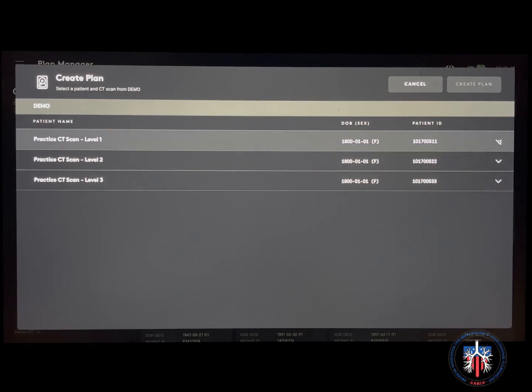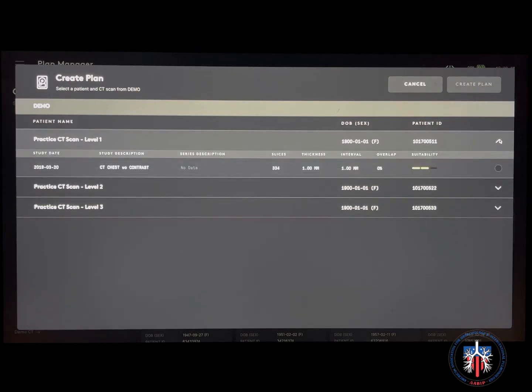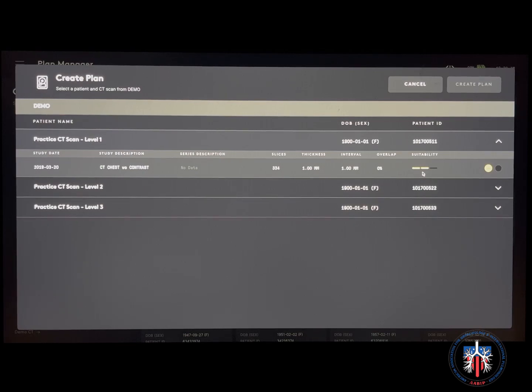Next, select the series of choice. A suitability mark will show up with a green, yellow, or red marker. A green marker means all parameters have been met. A yellow marker means that some of them have been met but the plan can still be created, and a red marker means that the plan cannot be created.